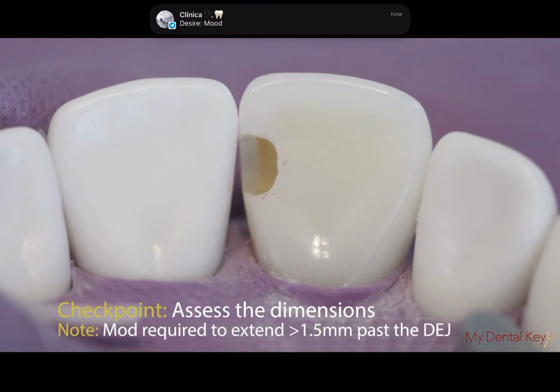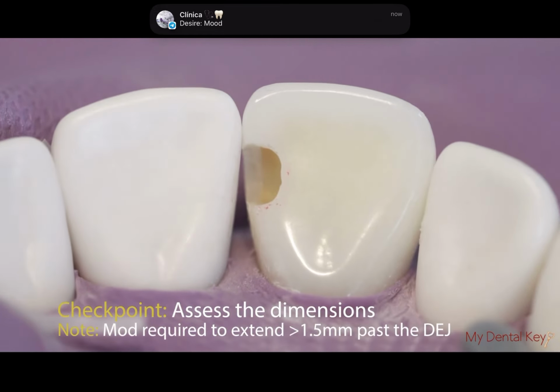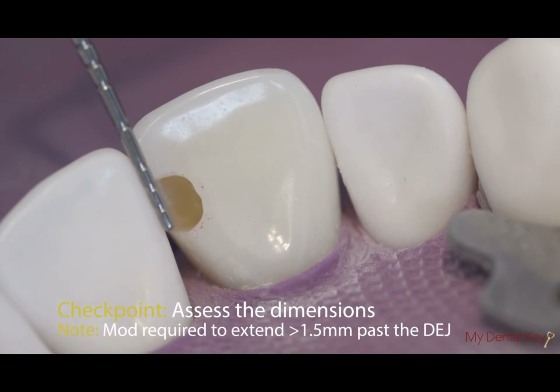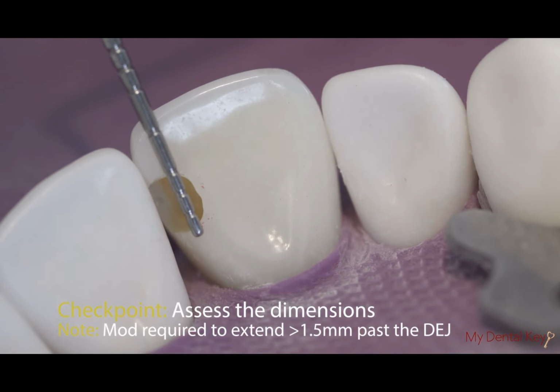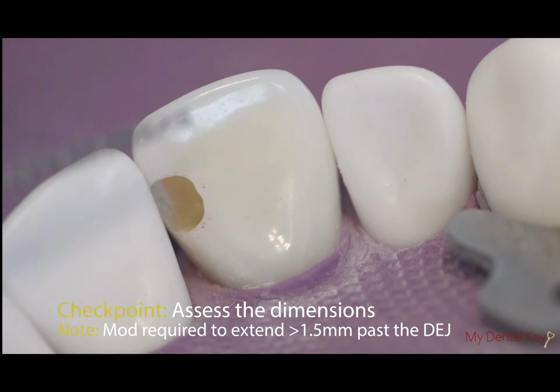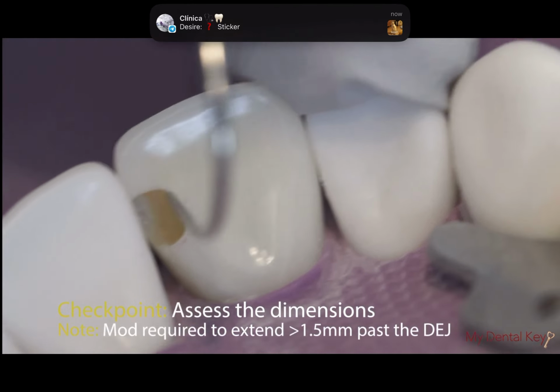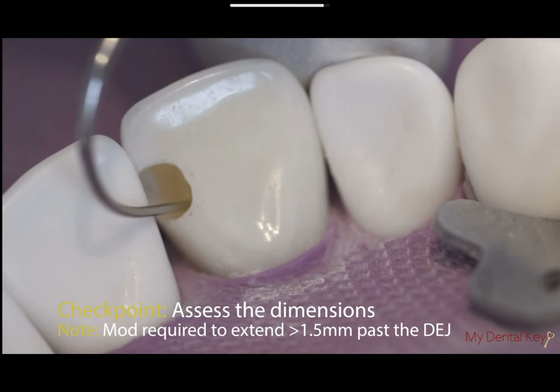At this check-in point, we are about 1.5 millimeters mesial-distally from the DEJ. In the incisal gingival direction, the preparation is less than 3 millimeters. In the mesial-distal direction, the preparation is about 2.5 millimeters. Using the Explorer, no remaining caries are found.